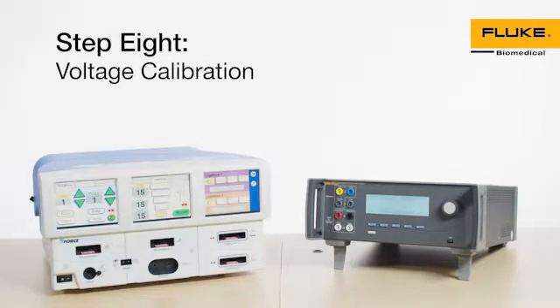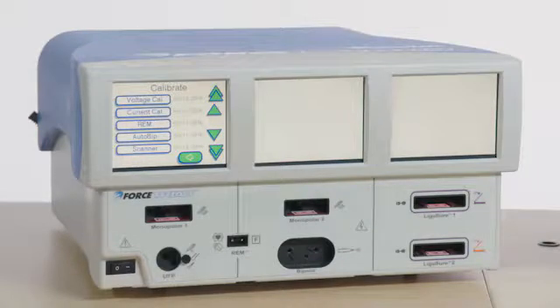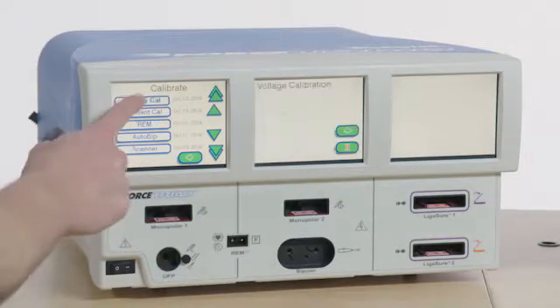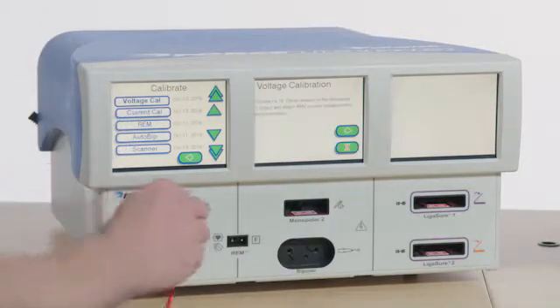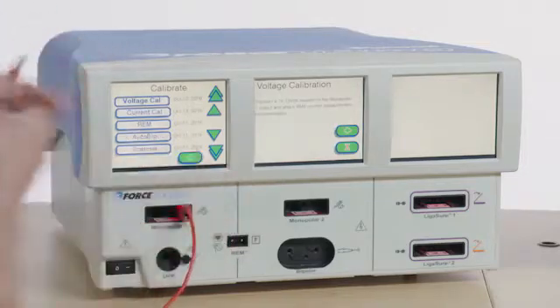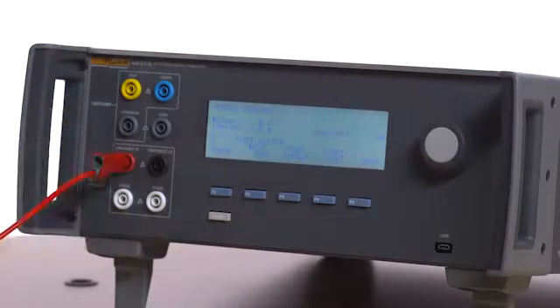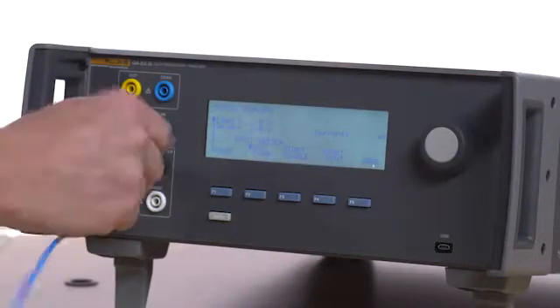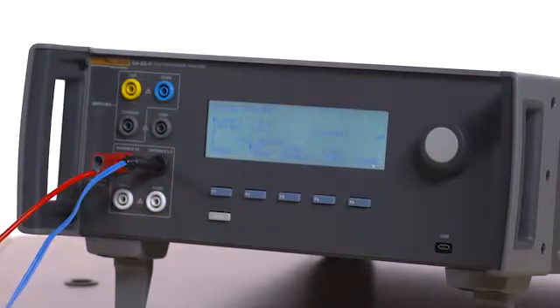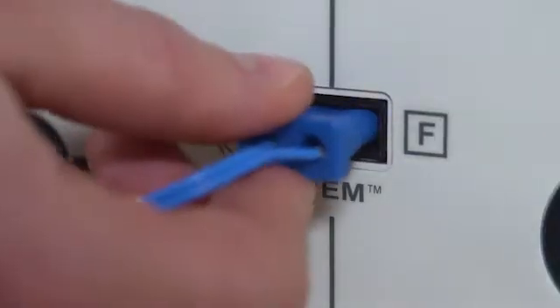Step 8 voltage calibration. Select voltage calibration from the calibrate menu on the Force Triad. Connect a red cable from the rightmost input jack of the monopolar port of the Force Triad to the variable high on the QAES3. Connect the ESU dispersive safety lead to the variable low port on the QAES3 and then the REM port on the Force Triad.